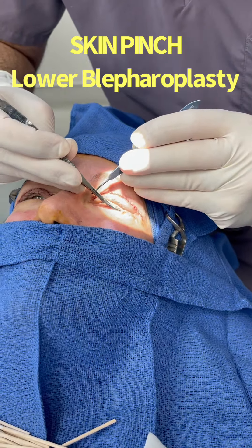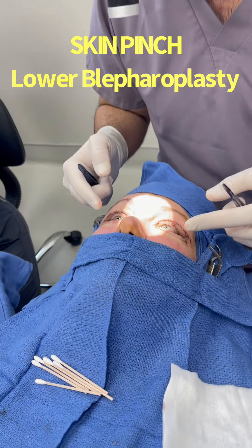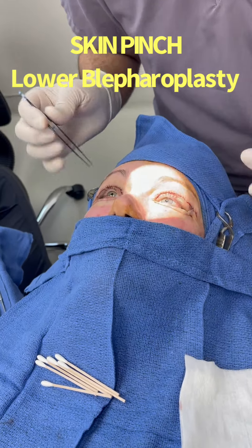Keep looking up please. The incision scar is going to end up being right below the eyelash line. This is the skin we just removed from the left side — it came out of the forcep. It's a fair amount of skin, it's kind of folded right now.